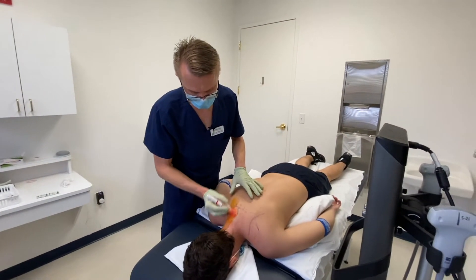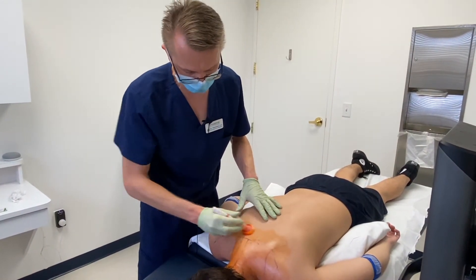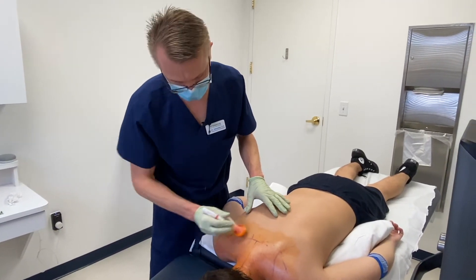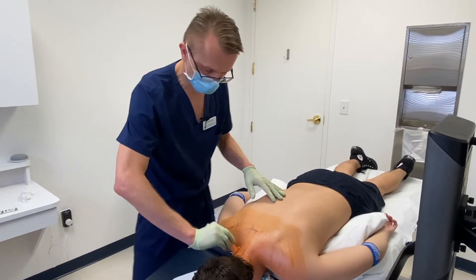Now that his neck and shoulder blades have been marked, I'm going to clean the area with an antiseptic. This is chlorhexidine and some alcohol — a surgical-type antiseptic — and it'll make sure that the whole area is nice and sterile before we get to the procedure.